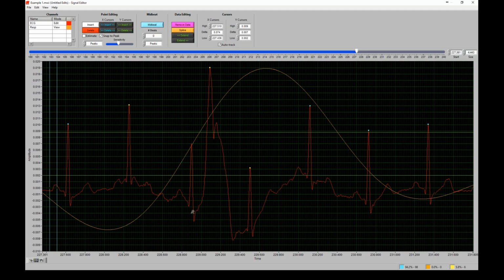And that's because of whatever motion artifact occurred following it being higher in amplitude and close enough to an ECG that it was actually flagged incorrectly by the peak detector. And then we can see after this noise that we can see a clear ECG signal again that has been marked properly, and then again and again and again throughout the rest of this particular window we're looking at.